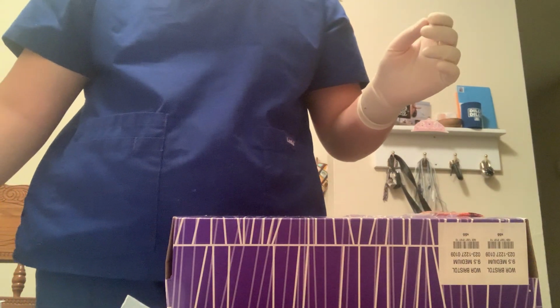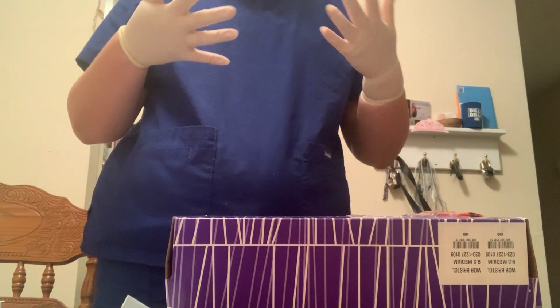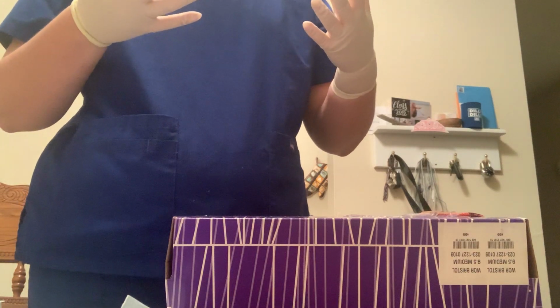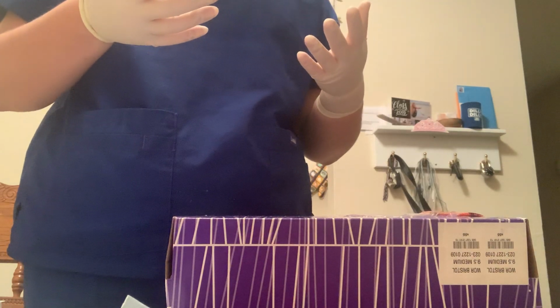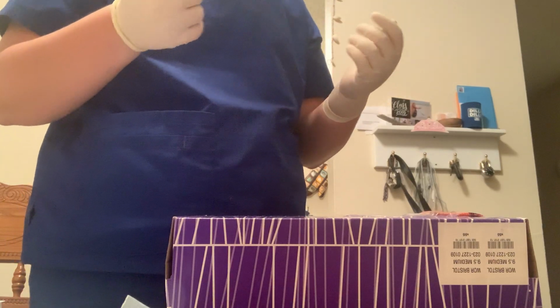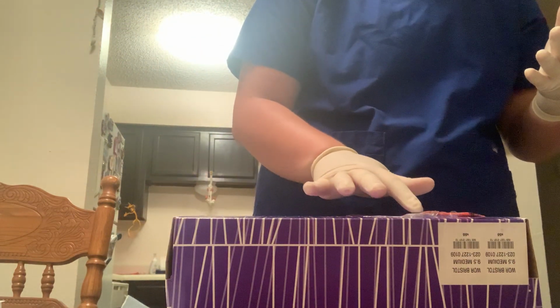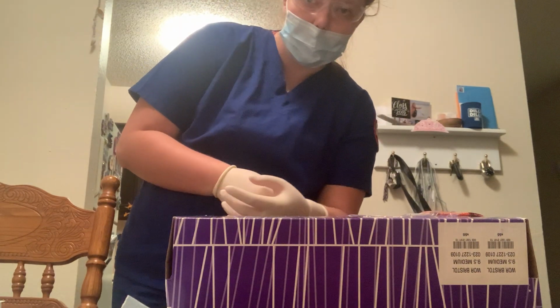So, that would include the appearance of the site, if there was any drainage, the amount of drainage, and what kind of drainage. I would also include if there were any cultures obtained, the type of cleanser I used, and the type of dressing that I applied. I would also include the date and time and my signature in the documentation. And then that concludes my CVAD.